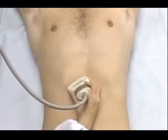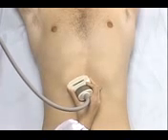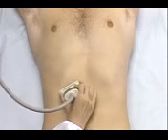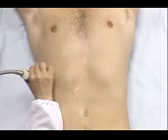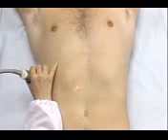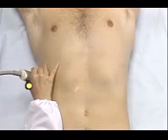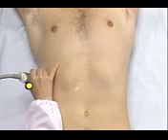In an obese patient, or a patient with a large amount of intestinal gas, this procedure may fail to detect the gallbladder. In this case, use the right intercostal scanning technique and scan the intercostal space between the 6th and 7th ribs, 1 or 2 ribs above the normal scan.